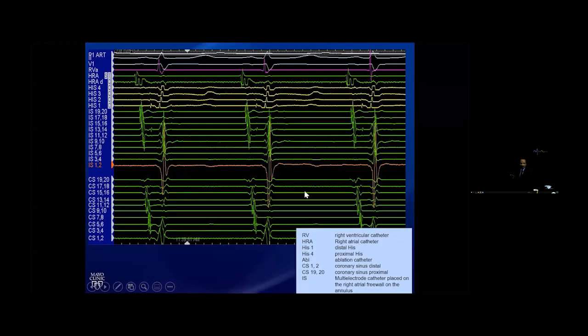So you don't ablate the early V. You'll have to identify where the signal is. Here, an isthmus type recording catheter on the free wall, finding that signal and ablating. The atriofascicular tract that you mentioned as the diagnosis is the correct one in this case. It's unique in pathways because we don't ablate at the early V. We don't ablate at the early A because the early A is never related to the pathway.